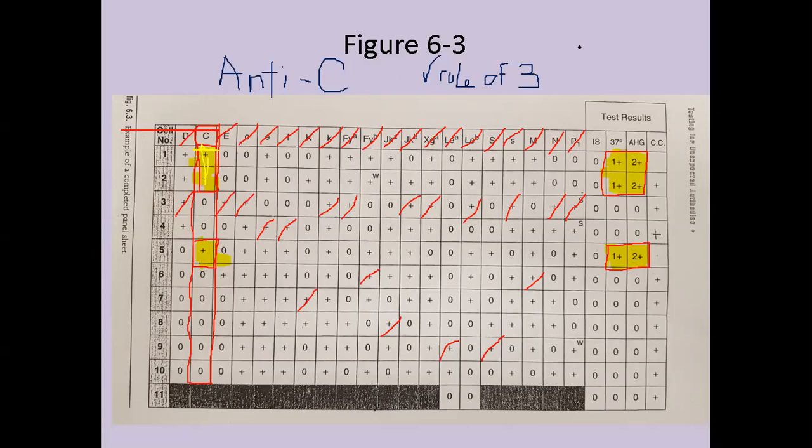So there are anti-sera in the lab, antibody against big C, 1 drop of that in a tube with 1 drop of my patient's 3 to 5% suspension. We expect them to lack big C because they have antibody against big C, and it's not auto because we see that this is all negative. Okay, so remember, we can always phenotype to confirm.